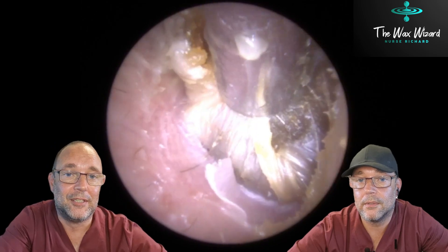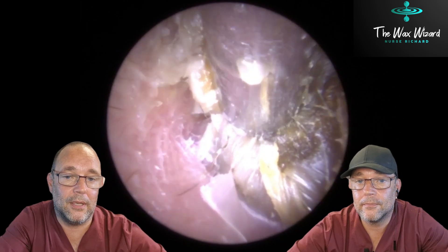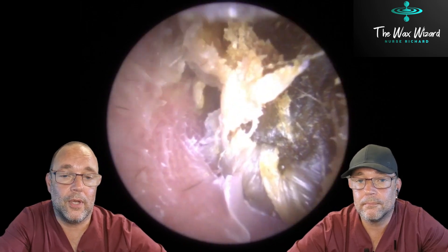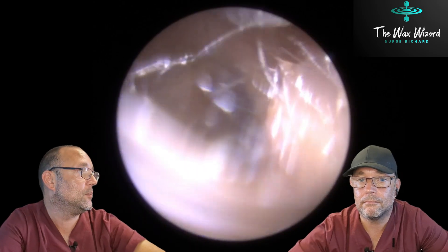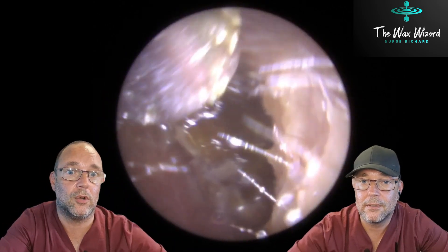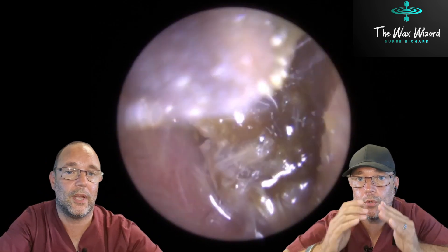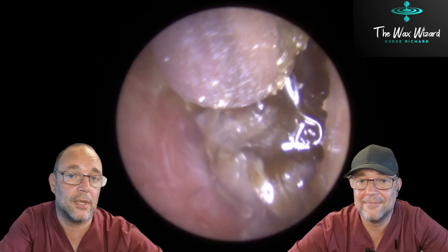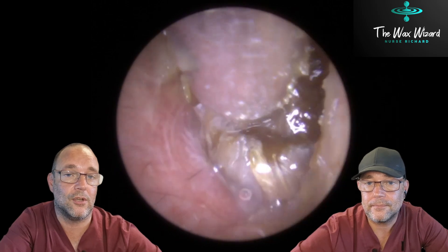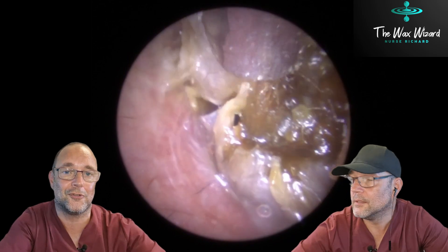Absolutely nowhere. I could have done this better. And you can see it bouncing up and down, but it's just not wanting to come out at all. So here we go. And as you can see, we've drowned it in oil. But that can cause a few other problems. What problems does it cause, Bob? You get blurring on the screen — it makes the screen go blurry. You get this wavy effect sometimes, which is why sometimes you have to just hesitate and wait for the screen to settle down. It's just oil on the camera lens, that's all. It makes it look like a dream sequence in a film.